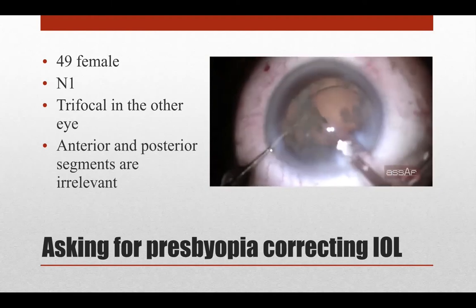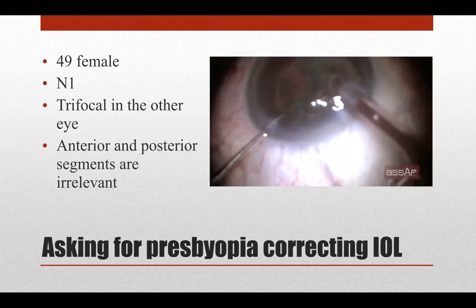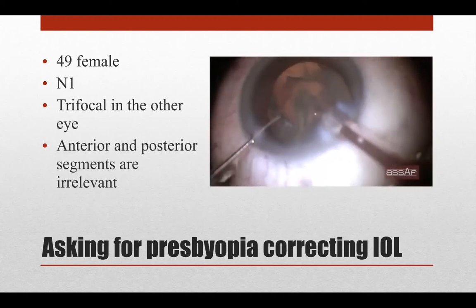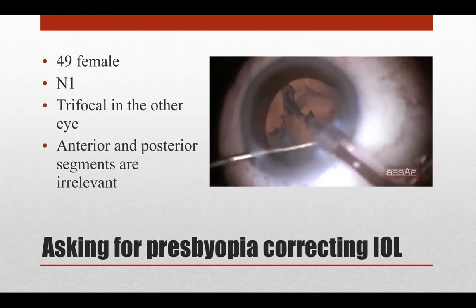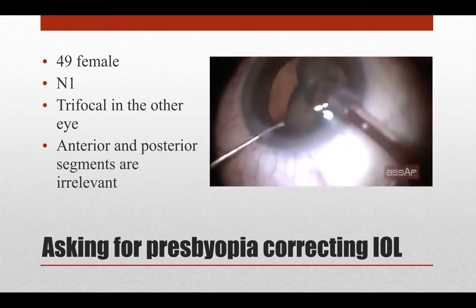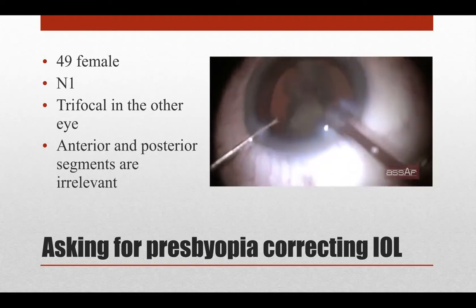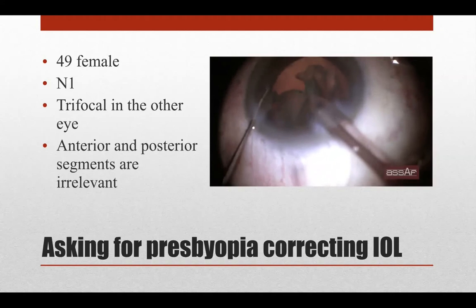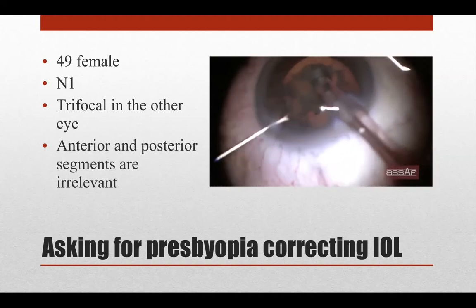We have a thick epinucleus. We can deal with it either with the phaco tip, or we can just do irrigation aspiration at this stage to clear this thick epinucleus. I found that it's better at this part of the surgery to stop phacoemulsification and continue irrigation aspiration, as you can see here.